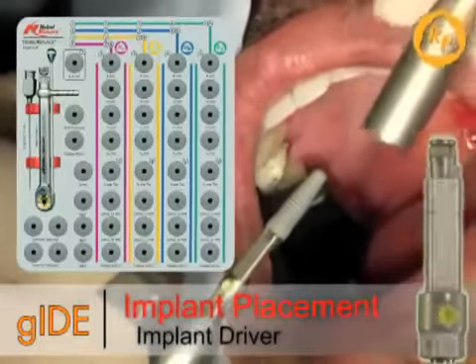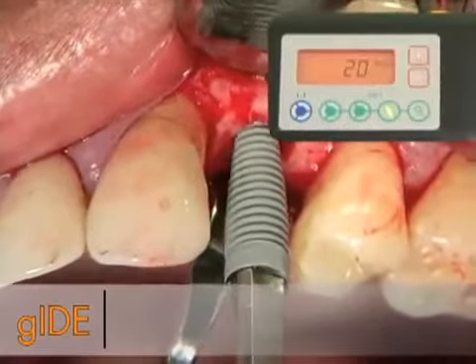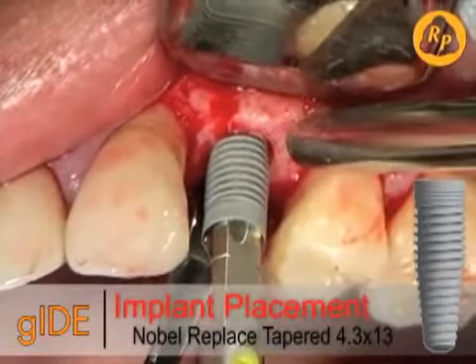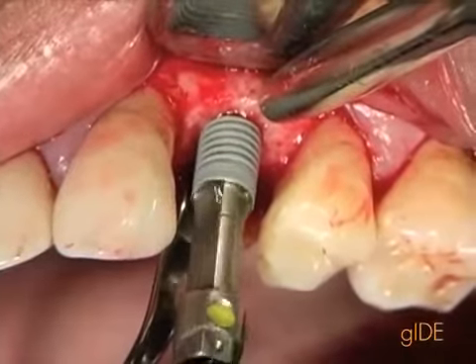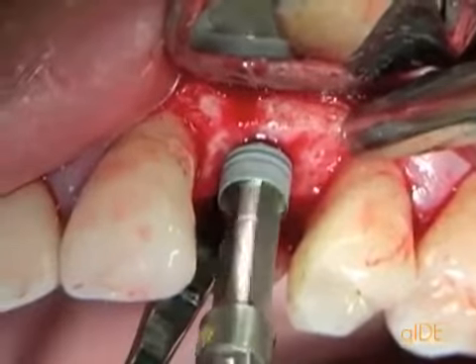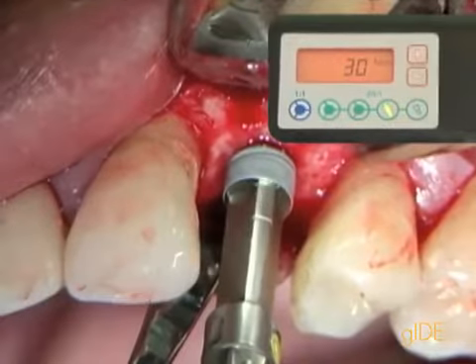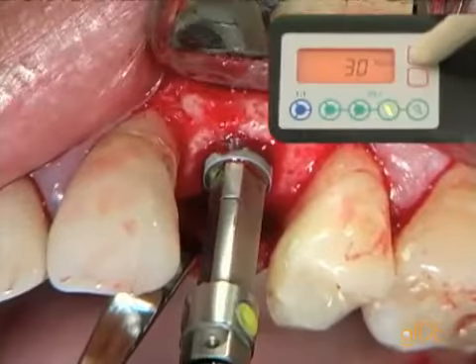The implant is pulled out of its titanium sleeve and then positioned in the osteotomy. The first torque used is 20 Newton centimeter, which will now bring the implant into the position. At 20 Newton it stopped, and we're increasing the torque to 30 Newton and continuing with the positioning of the implant.